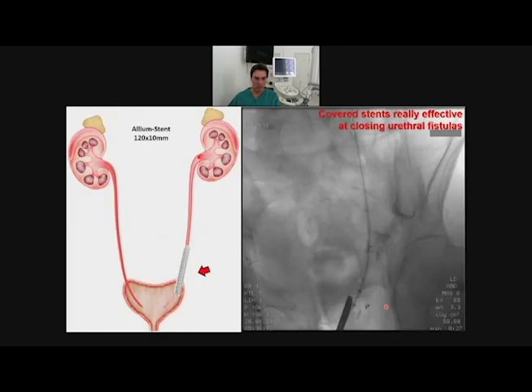What we do now is bring the stent inside. You see, it's like an umbrella. If you open it, it goes straight directly to the wall. And at the same moment, if you bring fluid inside, the leakage is closed, it all stops, and the fluid comes through.